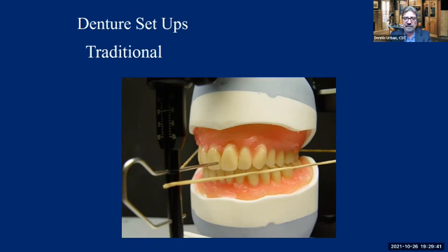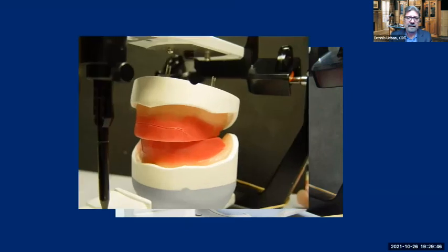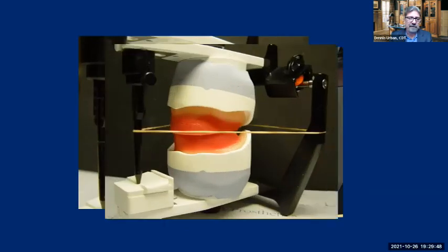So we put this on the articulator. What we'll do is line up the models the correct way. And I actually take a rubber band and put it on the incisal pin. There's a little slot in the incisal pin. And most of these semi-adjustable articulators and fully adjustable articulators have those little notches on the posterior region.